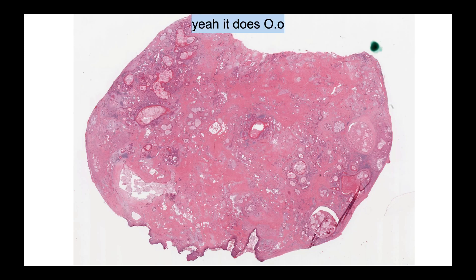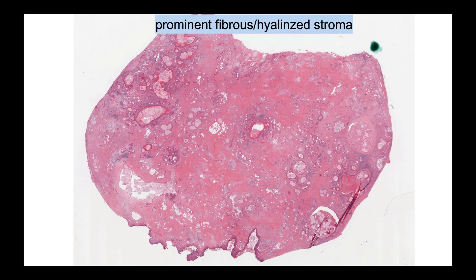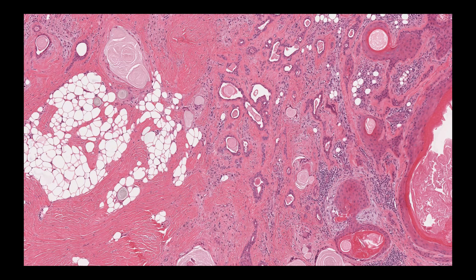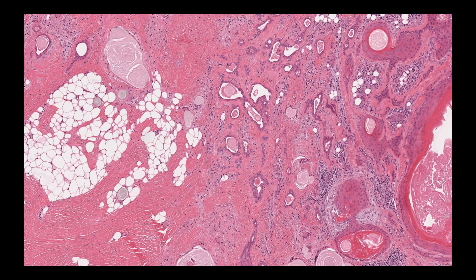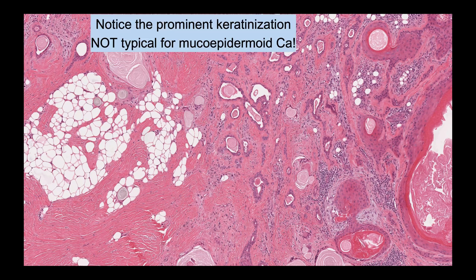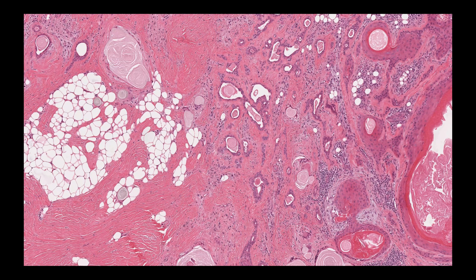This example looks different because the stroma is prominently fibrous with adipose metaplasia, and the cellular component shows squamous metaplasia. A pitfall to be aware of: pleomorphic adenomas may also show mucinous metaplasia with mucocytes next to areas of squamous metaplasia, mimicking mucoepidermoid carcinoma. A helpful distinguishing feature is that prominent keratinization is not a feature of mucoepidermoid carcinoma but is typically seen in pleomorphic adenoma.